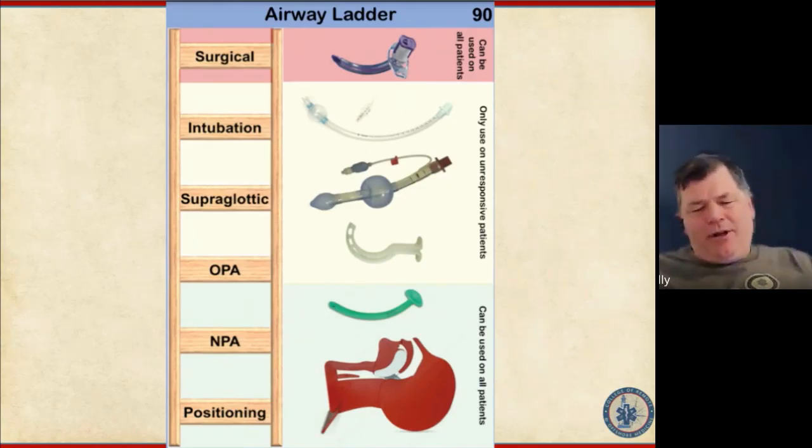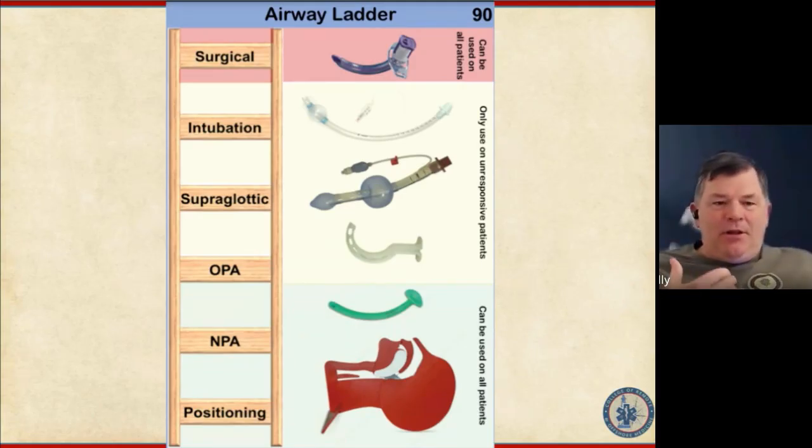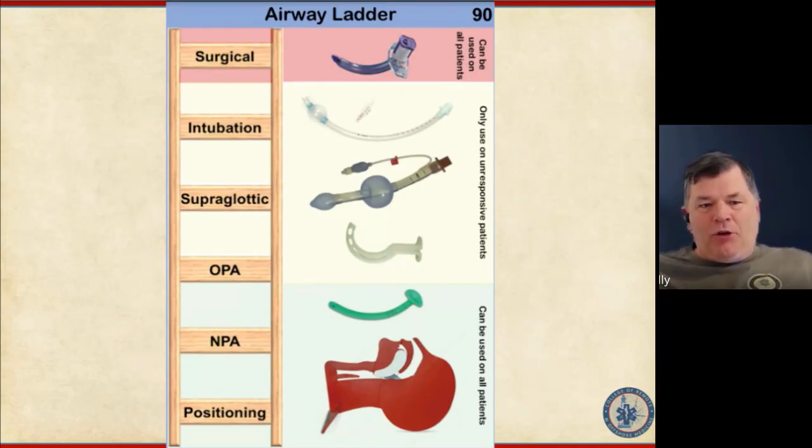And Bill, you had some comments on the OPA. So as we go further up and the adjuncts get more and more invasive, the line crossing into what you can use in an unresponsive patient isn't always as it seems.